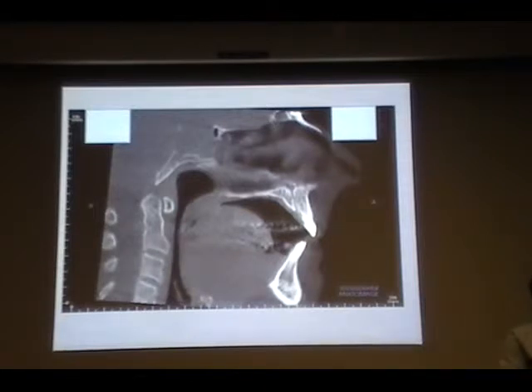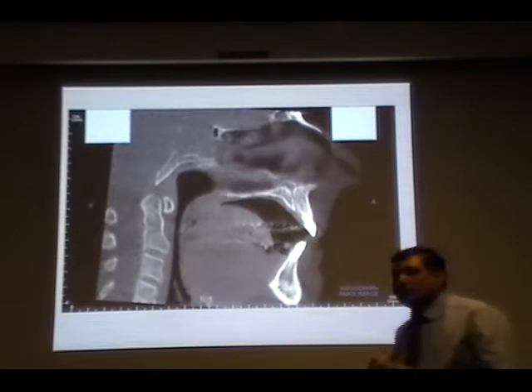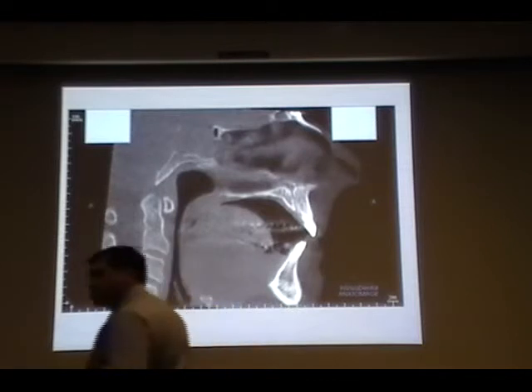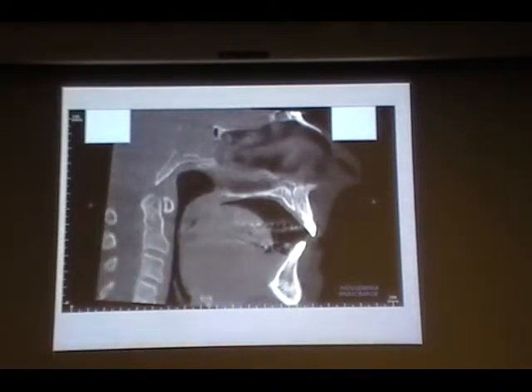So again, that's one of the reasons that you have to look at the scans completely, because you need to know the anatomy, how it is looking. Why do we only see 2 teeth in the sagittal view? If you cut exactly at the midline, you're going to see only the centrals, right? If you sagittally slice the head. So that's number 9 and number 24? Or it could be 8 or 25. You need to correlate. Here, what you're seeing is the incisive canal.